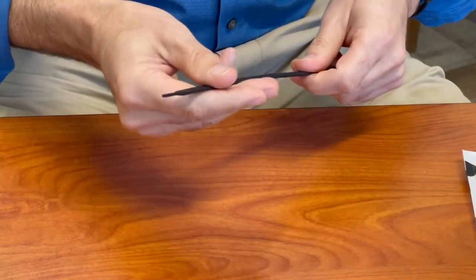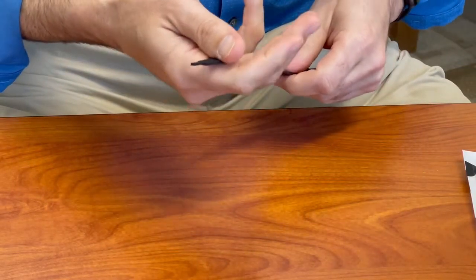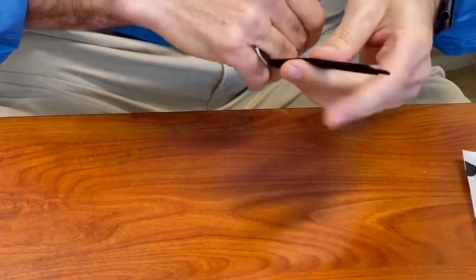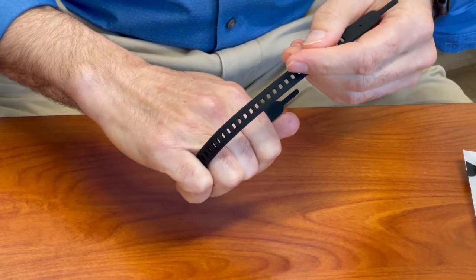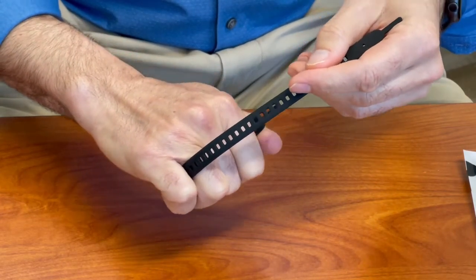Applying the hook splint. There are many ways to apply the hook splint, but this is just some general principles of how we designed it, but there are many ways to do it.